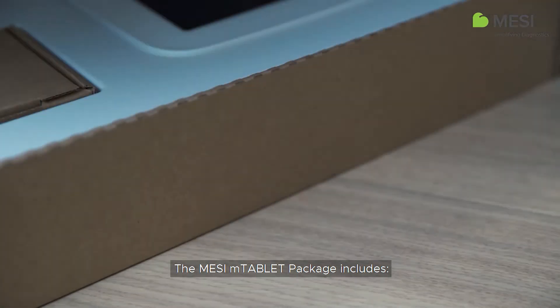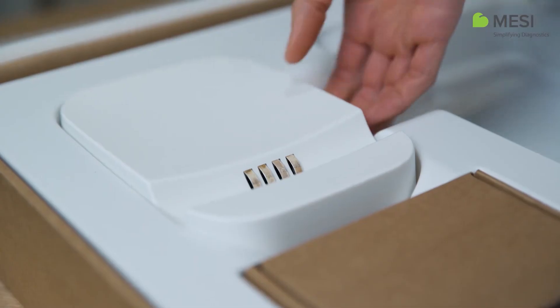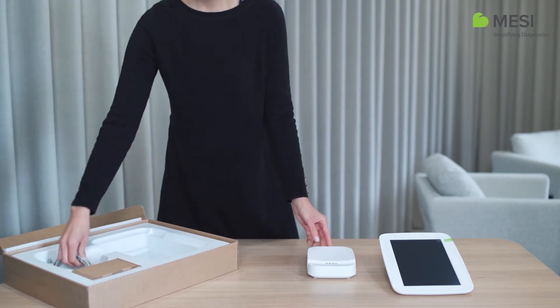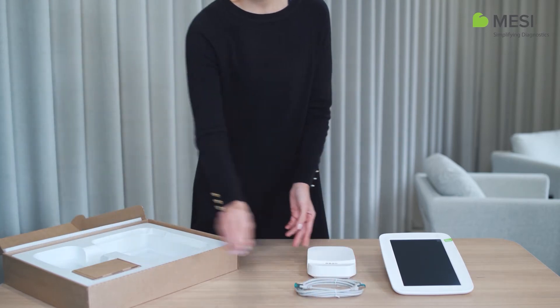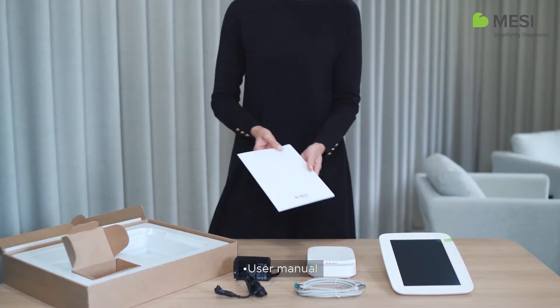The Macy M-Tablet package includes the Macy M-Tablet unit, the Macy M-Tablet docking station with access point, network cable, power adapter, and user manual.